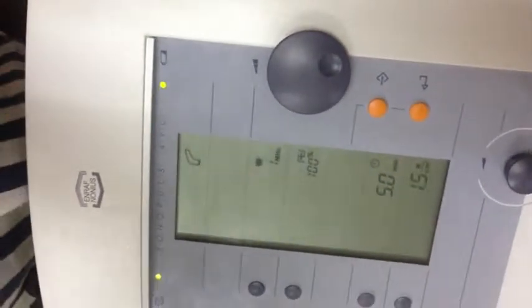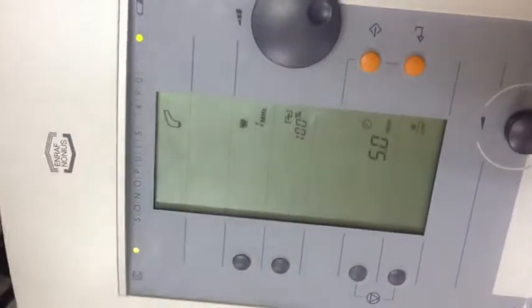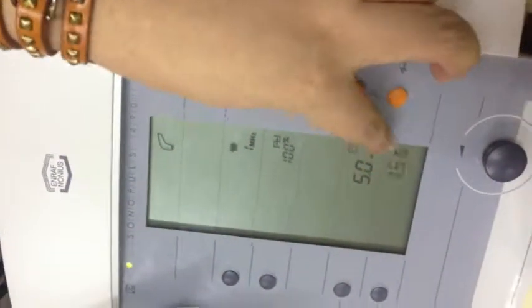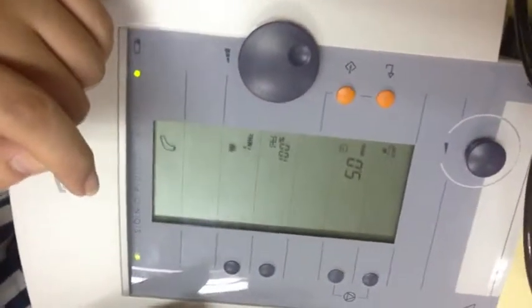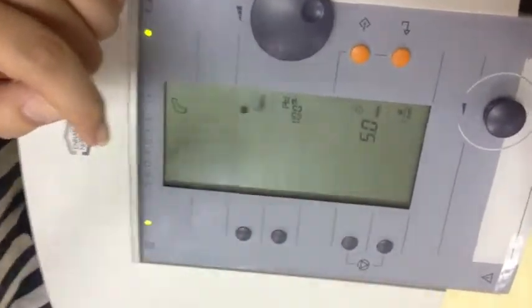So, that means 7.5 watts, pero distributed siya all throughout the area na tinitreat mo. So, pwedeng hindi equal yung distribution. That's why kino-consider natin yung surface area na tinitreat natin. Kapag low back, 5 minutes dito, 5 minutes dito, dapat may cm squared. Yes. Ang intensity natin, lagi dapat may centimeters.